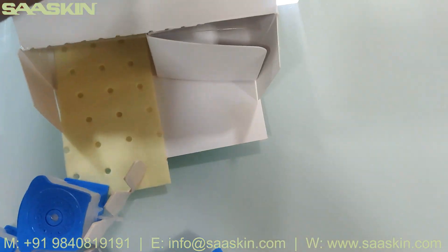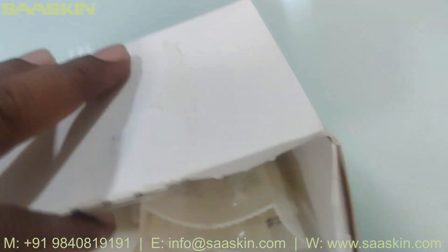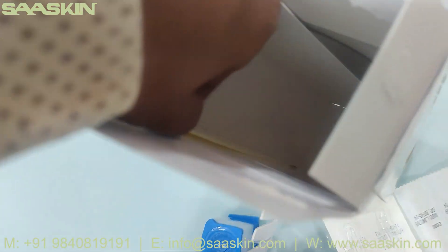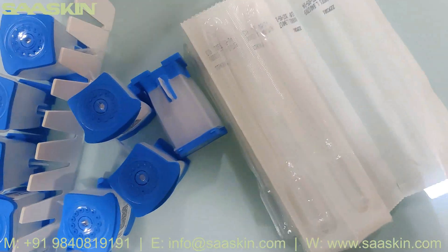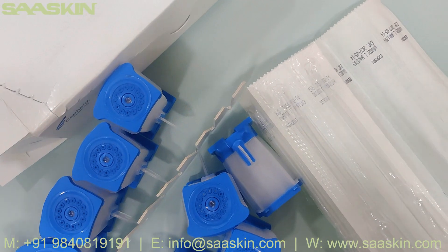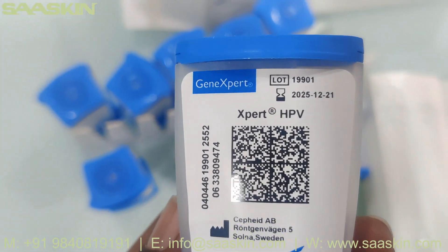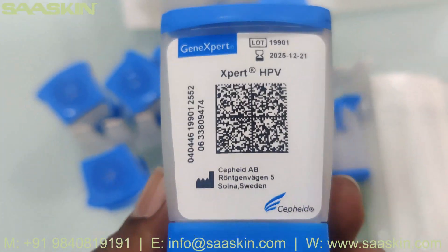Inside what you have is one CD here. There is one CD to be used as well. Basically in this 10 cartridges pack, you have the 10 cartridges. I just removed all the cartridges here — you can see these cartridges. On the cartridge you can see the GeneXpert label, the lot number is given, the expiry date, and Expert HPV.